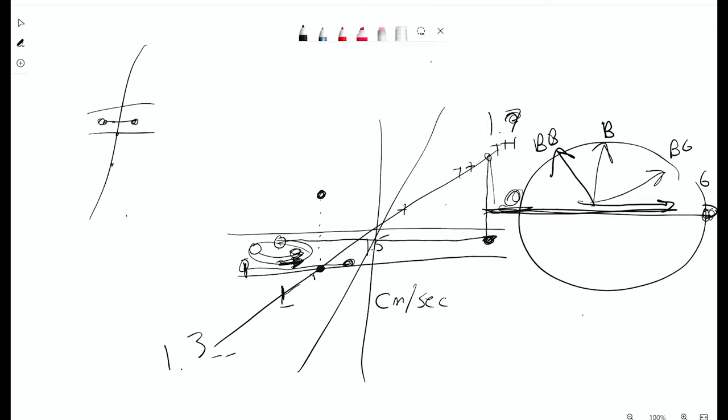Yeah, and for anybody at home that doesn't know the difference between through plane and in plane flow, it really depends on the flow of the blood in regard to the slice. If the blood is going through, perpendicular to the slice, that is through plane flow. However, if I was doing a sagittal candy cane here, you'll see that the flow is parallel to the slice. So that is in plane flow. Just so you know.